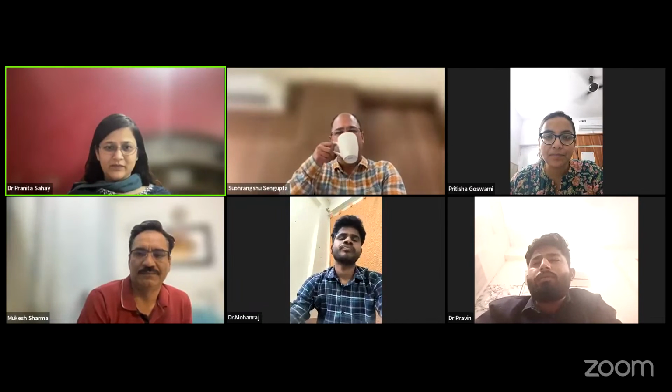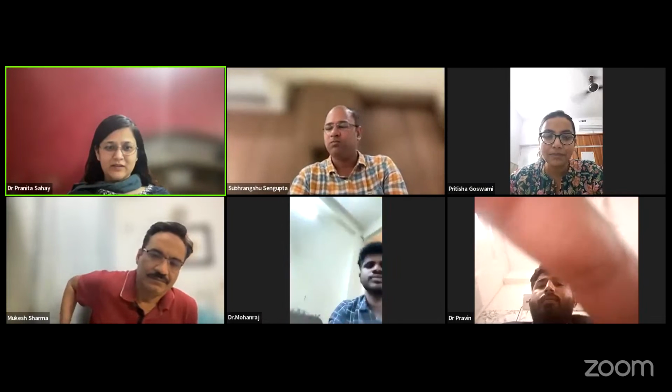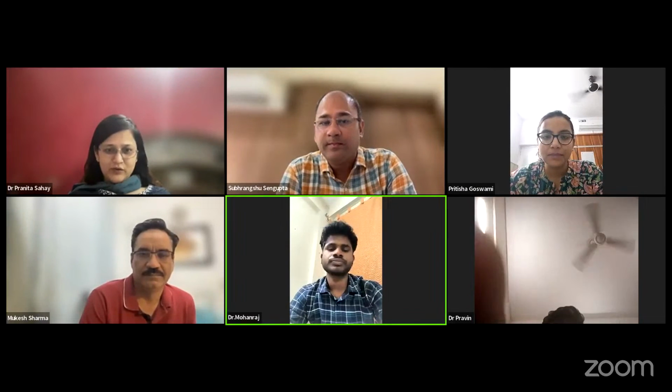Okay. So let's ask the students. Dr. Praveen or Dr. Mohan, would you like to let us know what are the different types of IOLs that you use in your hospital? Can you unmute yourself? Yes. You're using PMMA lenses, acrylic hydrophilic, acrylic hydrophobic lens.